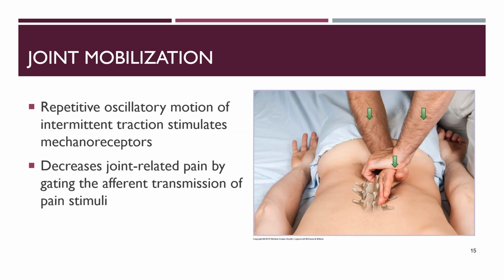We can also use mechanical traction for joint mobilization. There's plenty of techniques that you can learn manually whenever you're licensed and out working in the field. We're not going to spend a ton of time working on manual mobilization of the spine because that's something that is beyond entry level for a PTA and definitely a student PTA. But here's a nice technique visualized here in this image where you can kind of see here's your spinous process and your transverse processes off to the side.